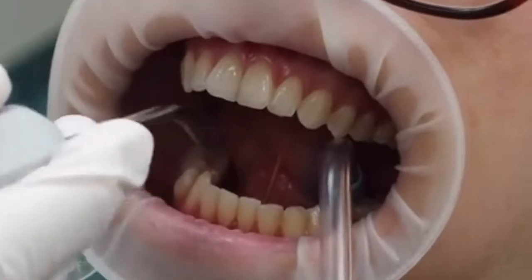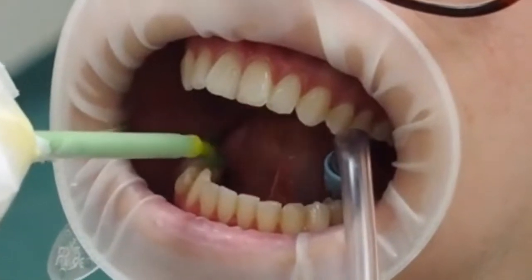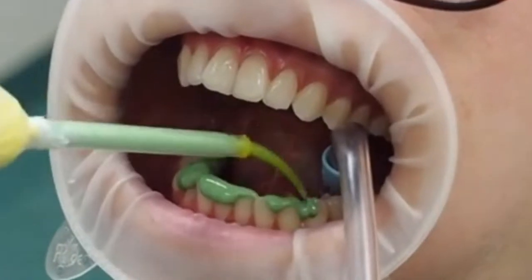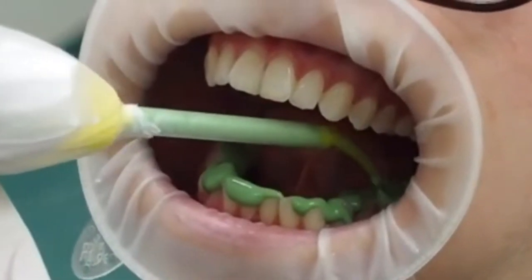While the first assistant is filling the tray, you're drying the teeth with air and suction — this is crucial for getting bubble-free impressions and great impressions of your gingival margins. You start injecting as the tray is half full, otherwise the warmth of the mouth will start to make it set ahead of time.